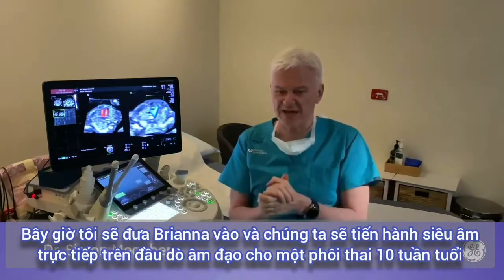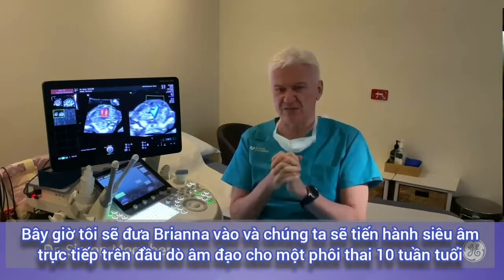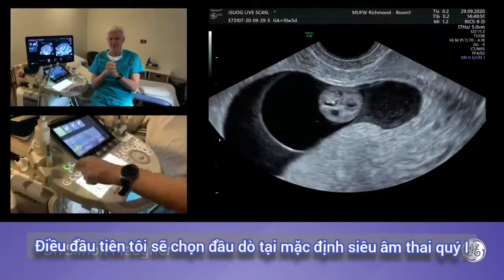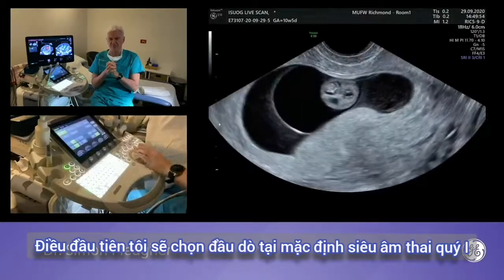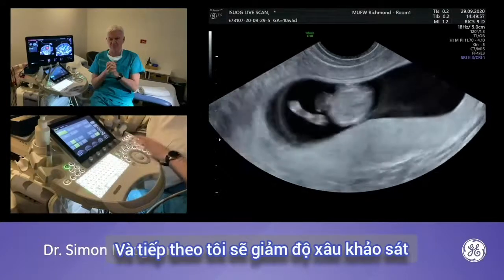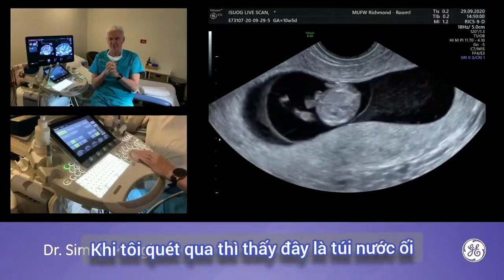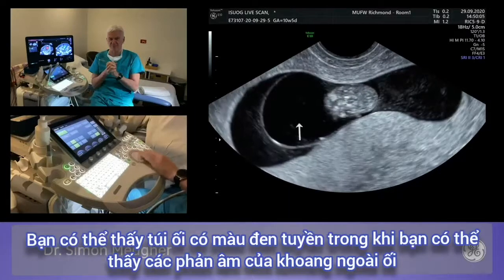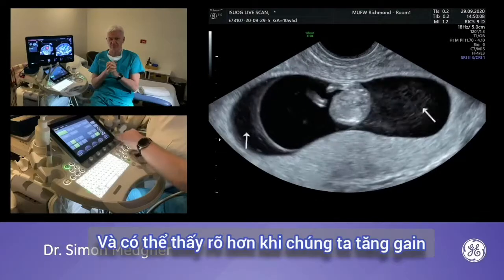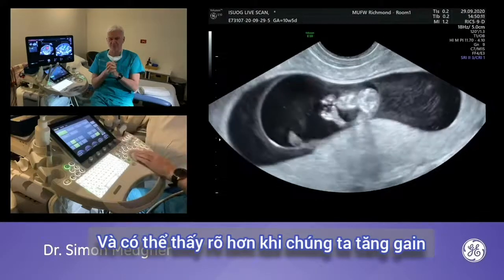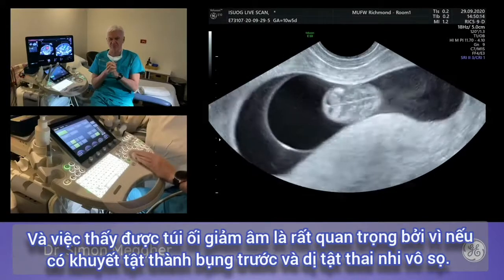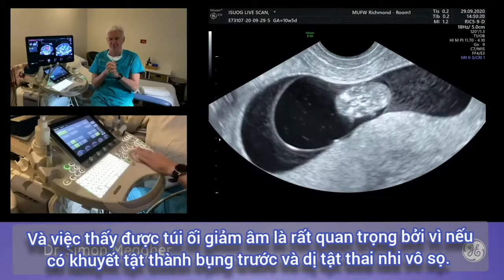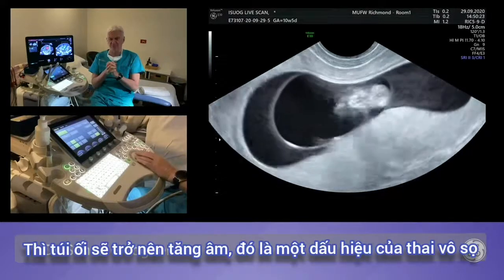We'll bring Brianna in and proceed straight to an endovaginal assessment of a 10-week embryo. I've selected the obstetric first trimester probe and reduced the depth. Sweeping across, here is the amniotic sac and here is the celomic space. The amniotic sac appears pure black, while you can see echoes in the celomic space — that can be made more prominent by increasing the gain. Seeing that hypoechoic amniotic sac is important: if there's an abdominal wall defect or acrania, it becomes hyperechoic, making it a marker for acrania.